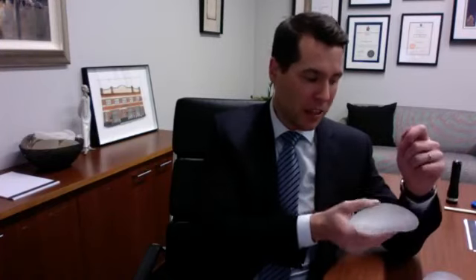So that type of hybrid breast augmentation where you're combining an implant with fat grafting can be a really useful thing. Now there's a question here, having implants put in as a 31-year-old, should I assume I will need replacement or removal in my lifetime? I would counsel you that it's likely that you will, but it's for one of two reasons. Number one, it is a product, okay? And the comment that I quite frequently make is, think about a paper clip. It's a really stable construct. It can hold all these things together. But if you sit there and pull it apart and start to wriggle, eventually it can snap. And the same with any of these implants.